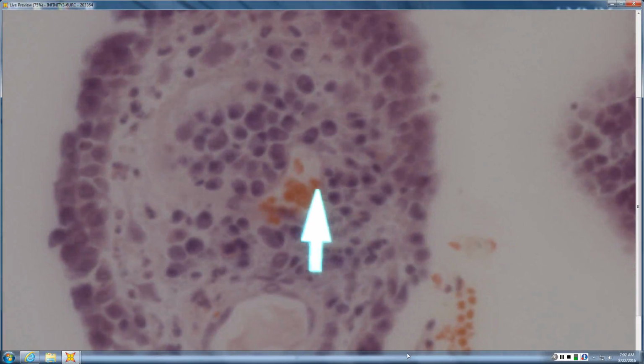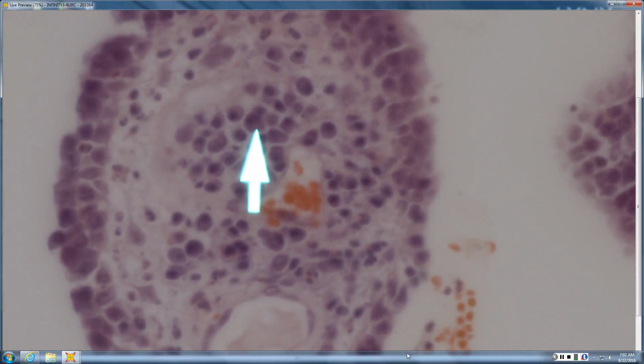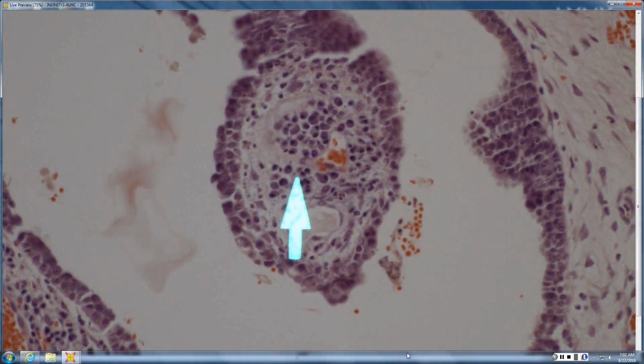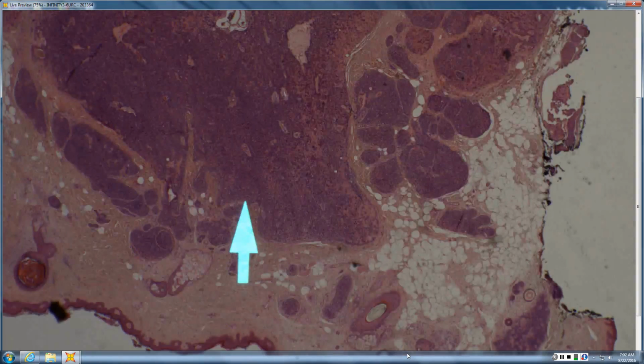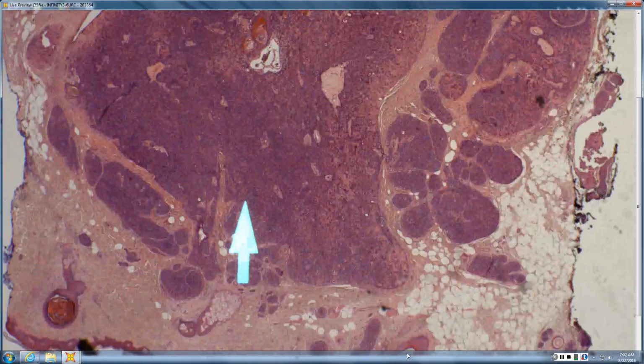Okay, it's a little bit hazy, but these have the clock face nuclei, and they have that little perinuclear halo of Hof. It's kind of hard to see actually, this is a little bit too close. But so tons of plasma cells. Those are always good to recognize. So anyways, this is SCAP. When you compare that to HPAP, it's usually in hidden locations, so vulva and whatnot, breast. If it's on the nipple, of course, then that's when it becomes erosive adenomatosis of the nipple, or nipple adenoma.